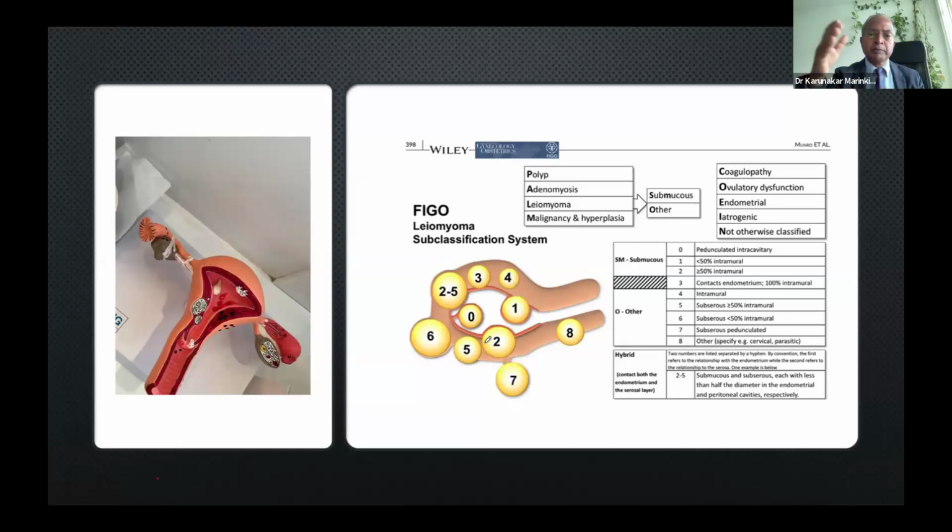In infertility, you chop them off and create endometrial sclerosis. Every lesion, you always blame that it is the cause. But if you're not going to show the cause-effect relationship with a high degree of evidence, and also the benefit of your intervention in improving implantation-friendly endometrium, you're just gambling with the patient's body, and that's not on.